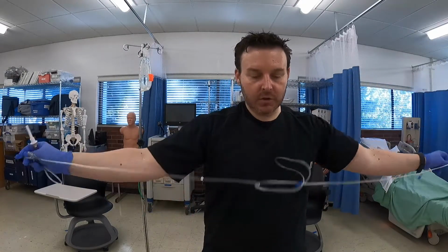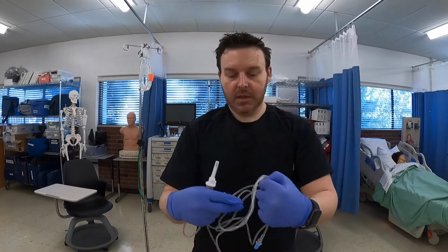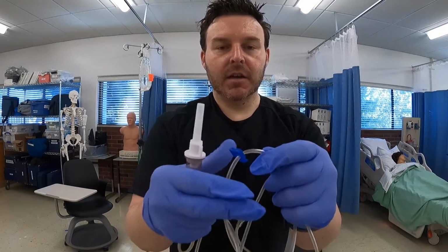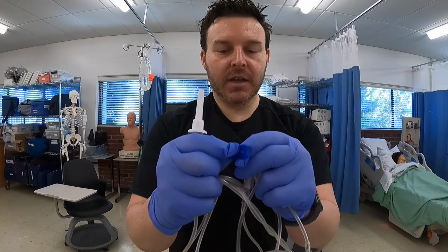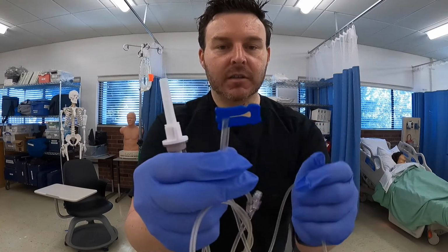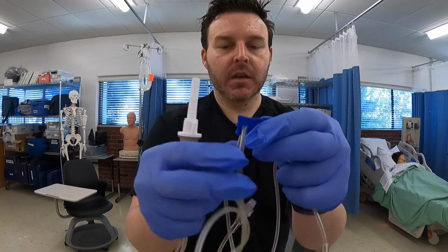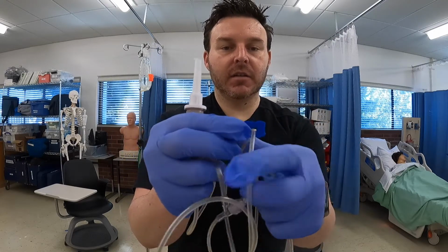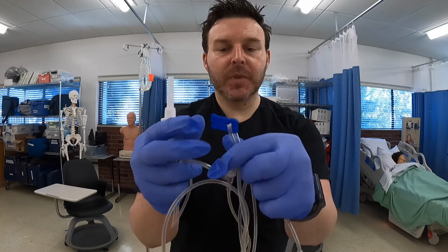The first one that I want to show you is this dark blue one. Basically, if you push it this way, it clamps the tubing so nothing can go through. If you move it in this direction, then of course the fluid can go through that direction. This is also going to be the key for our IV pump.